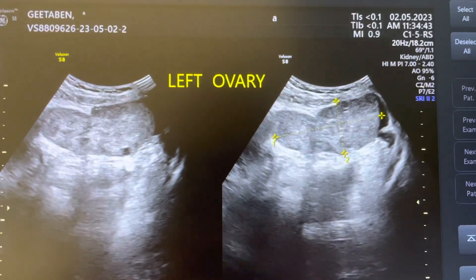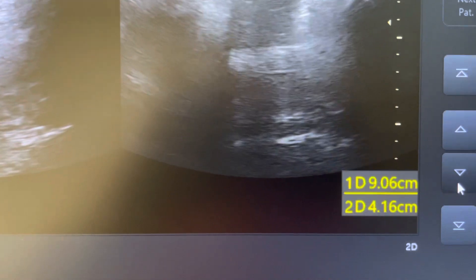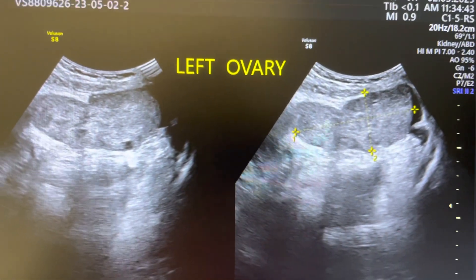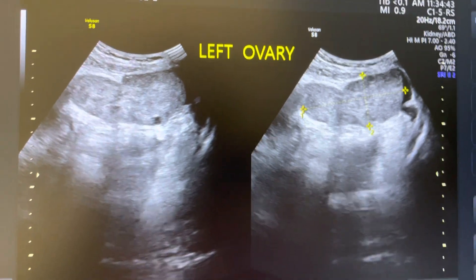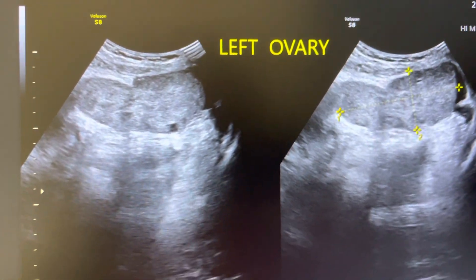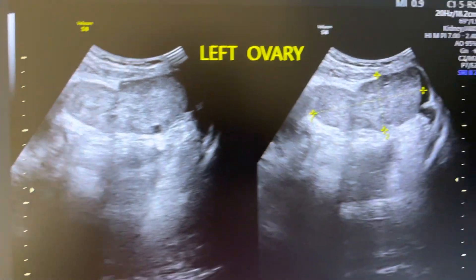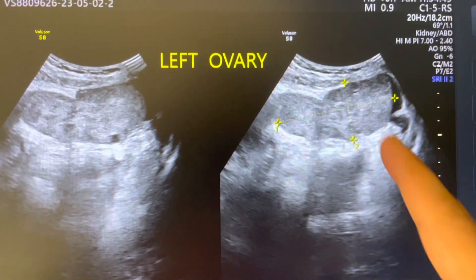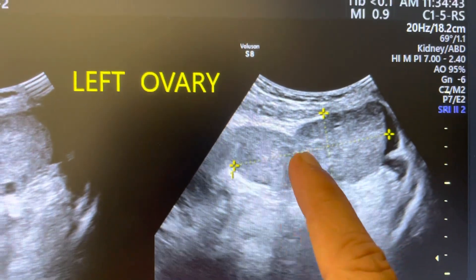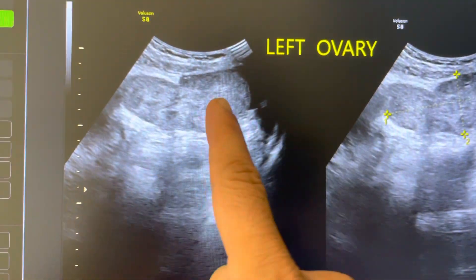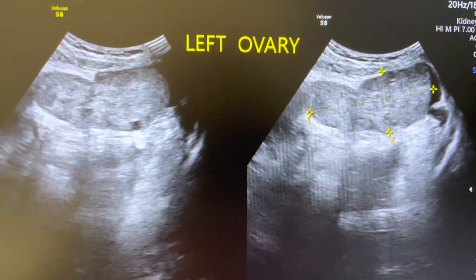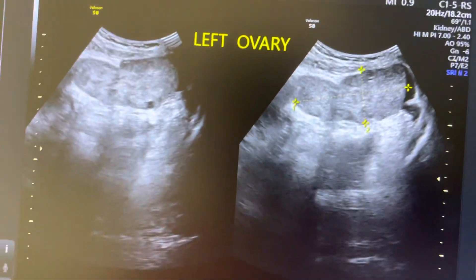The left ovary is enlarged — 9 cm by 4 cm. You can see that the normal texture of this ovary is lost. There is a central echogenic area here, and the overall texture of the ovary is lost.